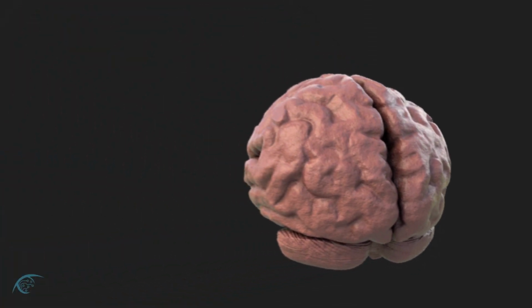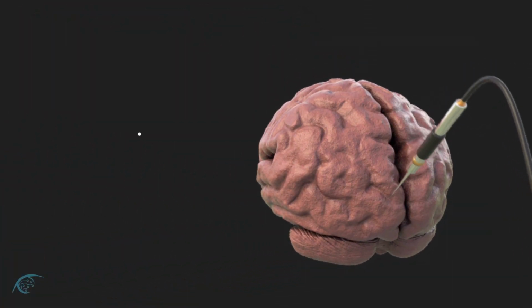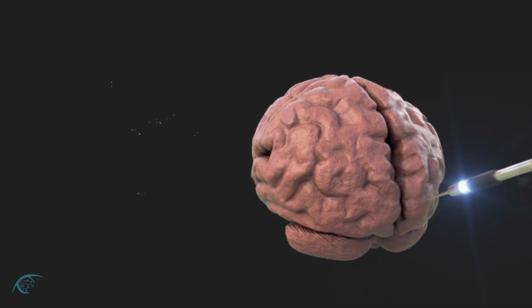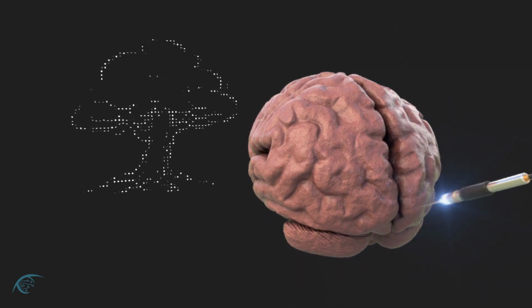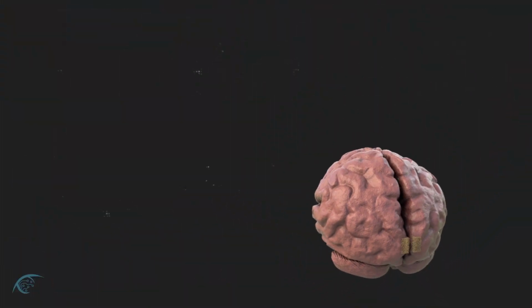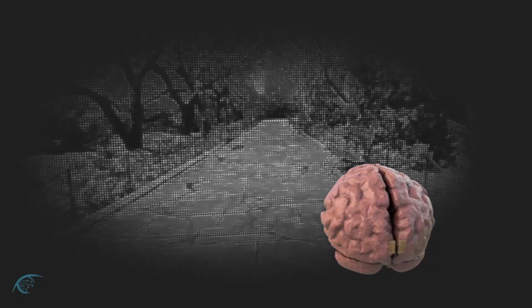The implant works thanks to a property called retinotopy. This means that a stimulus in one spot of the visual cortex of the brain causes you to view a dot in a well-defined location in your field of view. With multiple stimulation points, you can create shapes and even images. With thousands of stimulation points, useful video can be transmitted directly to the brain, even if the eyes or the optic nerve are completely dysfunctional.